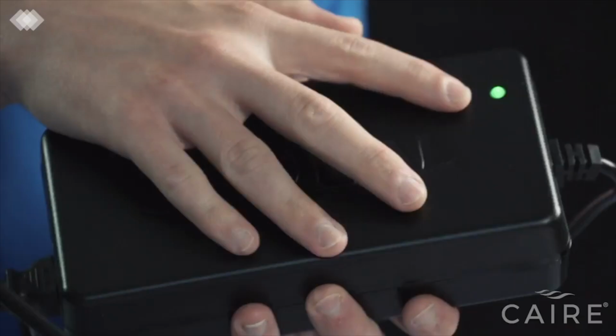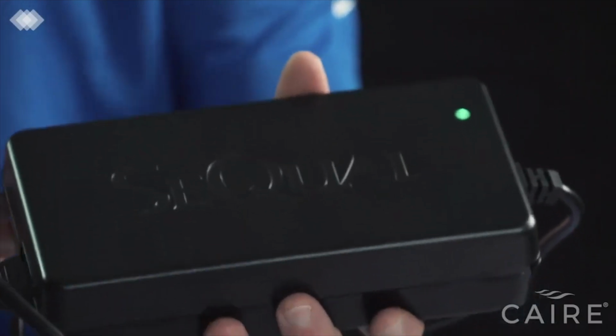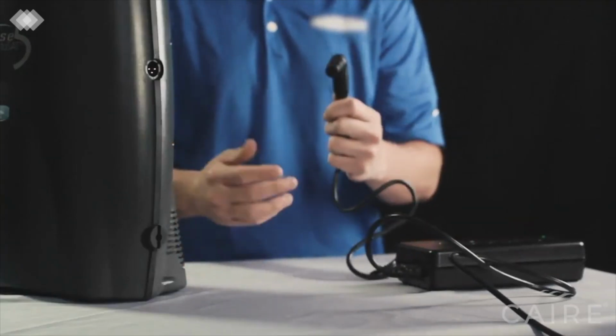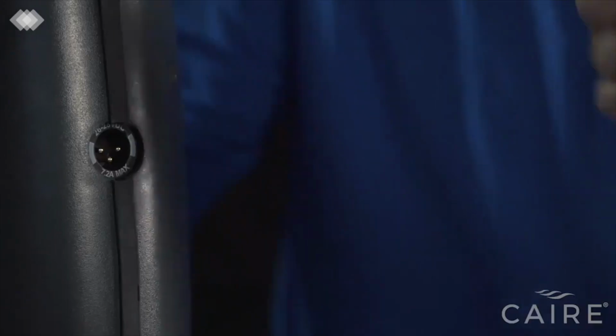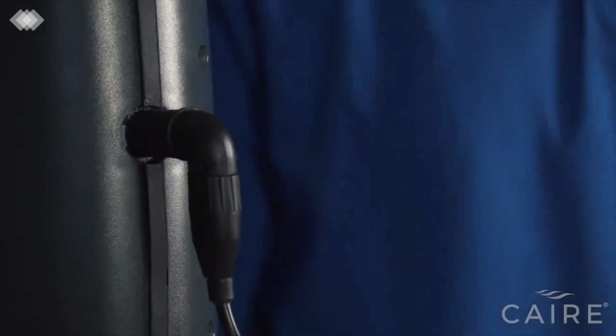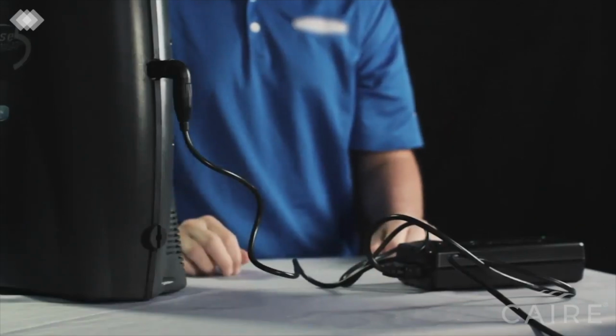Once you're plugged into external power, either the wall or in your vehicle, you should see a green light come on top of the power supply brick. This indicates that you're receiving external power from your source. At this point, you're ready to plug into the side of the Eclipse to begin charging or using it. Note that it's a right-angled connector, and you'll need to keep this upright as you plug it in. So just slide it straight in there. There's no connection button or twisting. And you'll hear that beep to let you know that you're plugged in and receiving power.